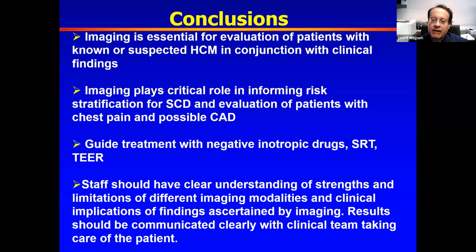Can you comment on left ventricular outflow tract obstruction without septal hypertrophy or without even hypertrophy? How do you evaluate it? How you evaluate it is less of a challenge as opposed to how you treat it. Since the question is about evaluation, that is what I will stick with. You want to look and see whether there is an anterior leaflet or either of the two leaflets of the mitral valve touching the septum or not.